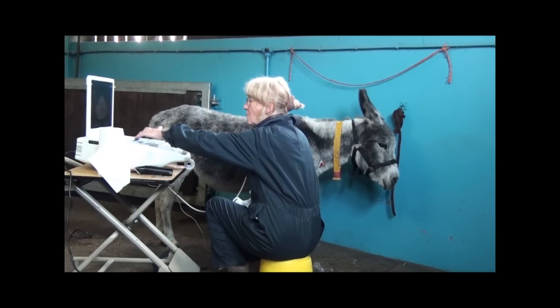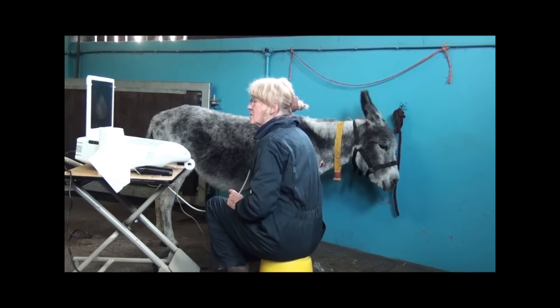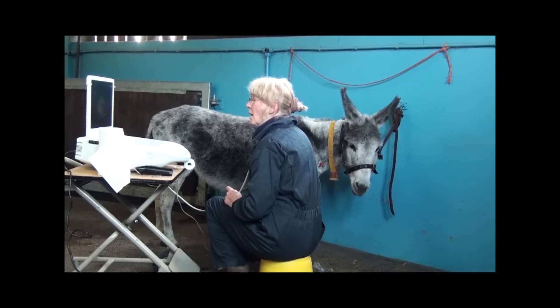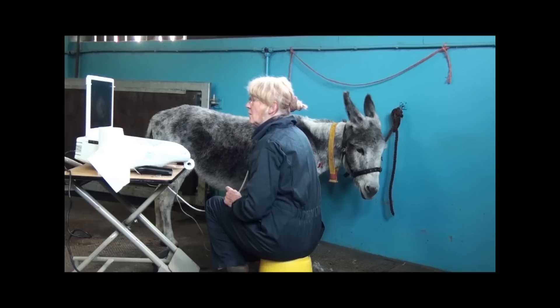The aim is to establish a database of measurements of normal donkeys so that they can be used as a reference when the vets here are examining sick donkeys. They'll have a reference range of normal values of the dimensions of the chambers of the heart.